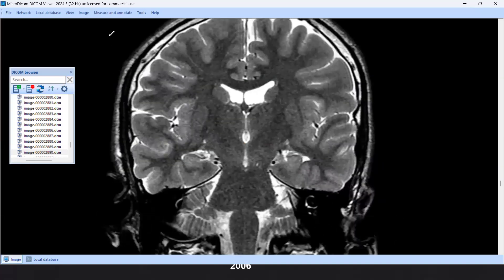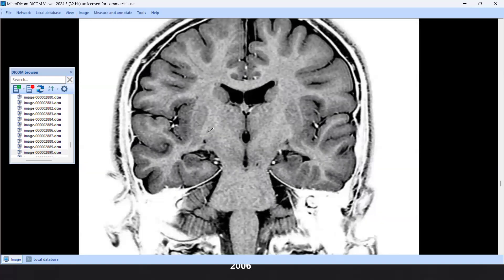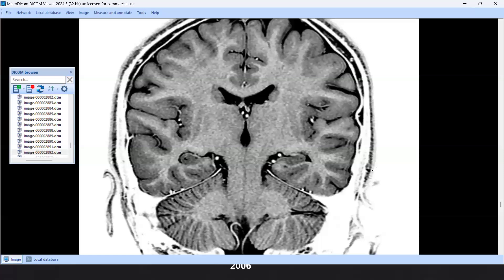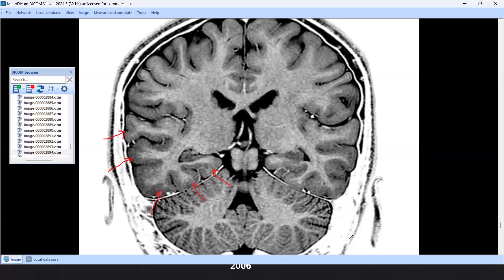To identify the gyri more clearly, we can invert the image — this is much more helpful. On this inverted T2-weighted image, we have the parahippocampal gyrus, fusiform gyrus, inferior temporal gyrus, middle temporal gyrus, and superior temporal gyrus. Starting from medial: parahippocampal, then fusiform, inferior, middle, and superior temporal gyrus. We also have the small collateral sulcus — more or less horizontal in orientation and parallel to the temporal bone.